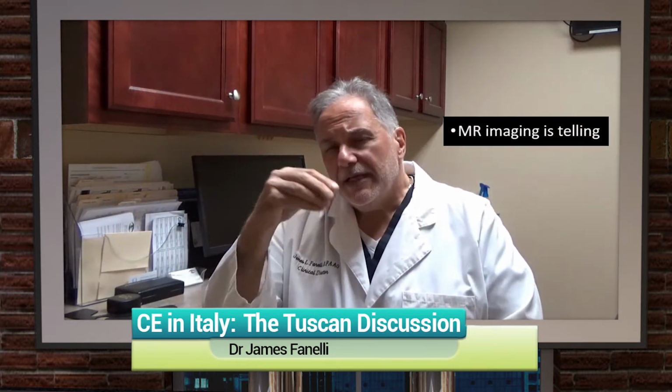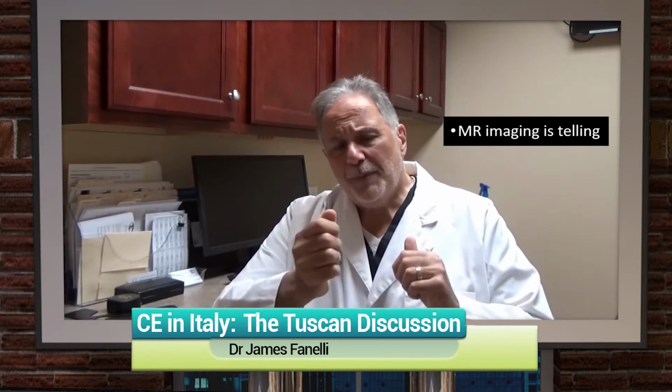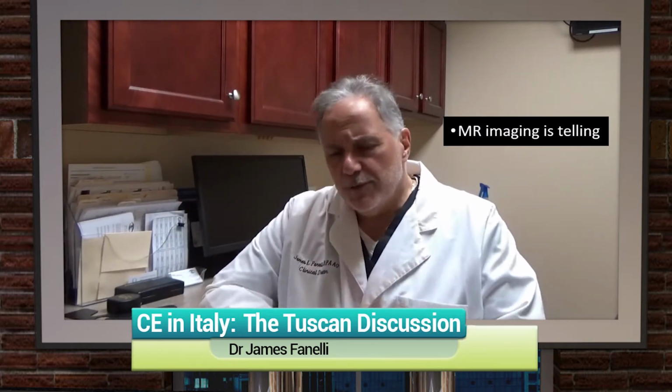MR findings give us a pretty good indication of what we're going to see in our clinic when we utilize OCT technology. And for the most part, since OCT technology is readily available for all of us, we have that technology in our office, and we can use some of the clinical differences in OCT images between papilledema and optic disc drusen to guide us as to which of those two diagnoses we actually have.